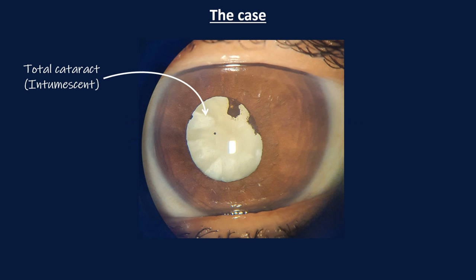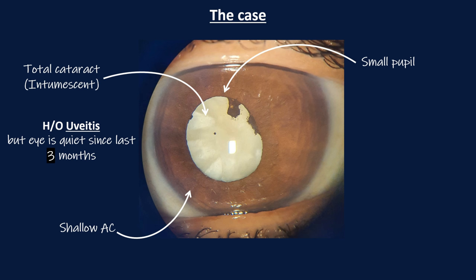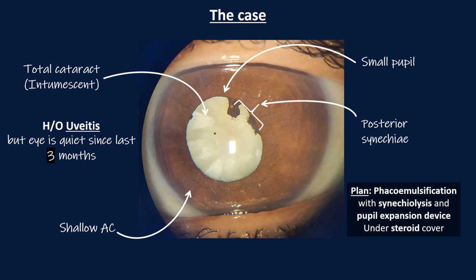This patient has a total cataract which is intumescent. There is also a history of uveitis, but the eye has been quiet for the last 3 months. The anterior chamber is shallow and the pupil is small with presence of posterior synechiae. The plan is to do phacoemulsification with synechiolysis and use a pupil expansion device under steroid cover.